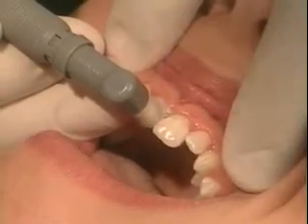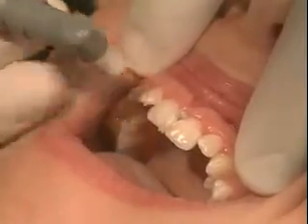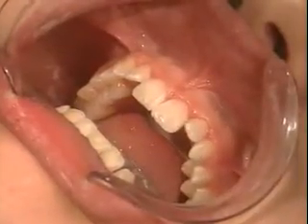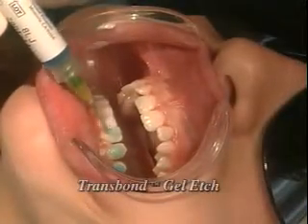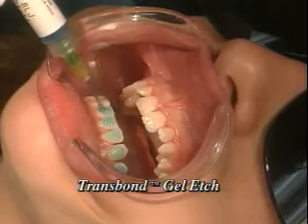Follow your normal tooth preparation procedure. The teeth must be cleaned, isolated, and etched. Apply Transbond gel etch to the lower arch. Time according to the manufacturer's directions.